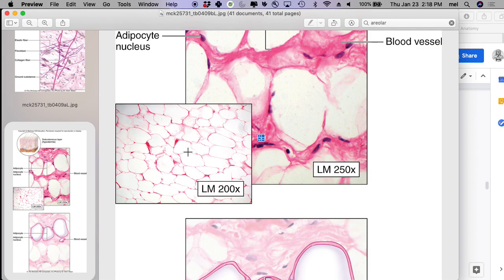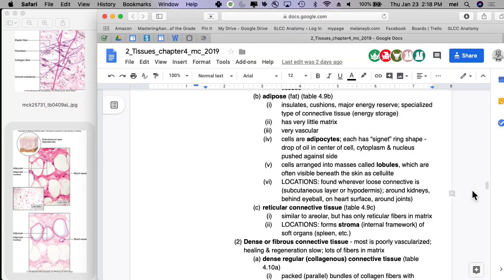And that is not empty. That is full of fatty acids that I could burn later if I needed them. Does that make sense? So it's got that lipid vacuole inside of it. And a single cell is called a what? Yeah, so what is this guy called right here?